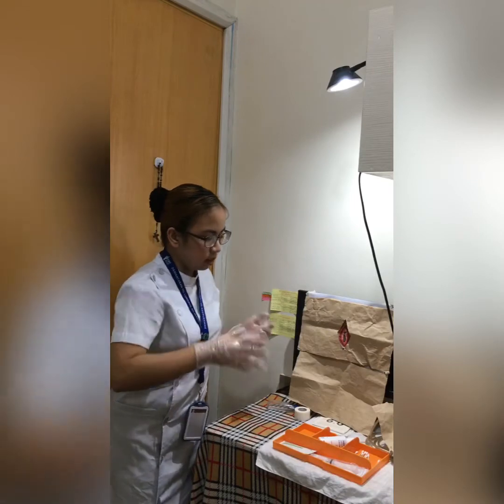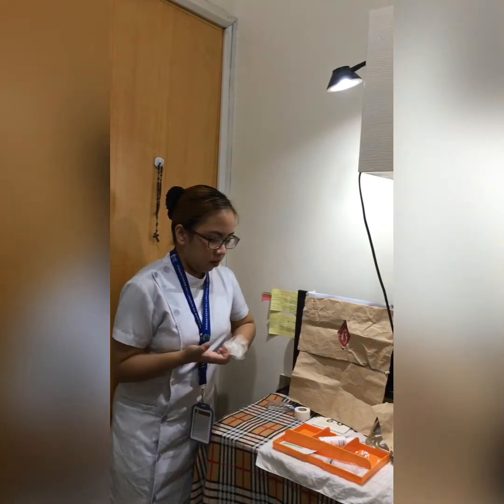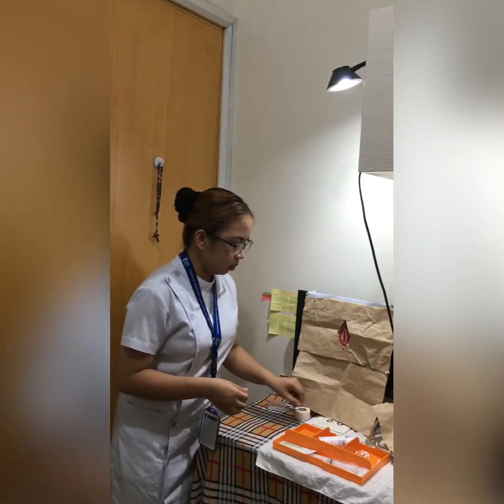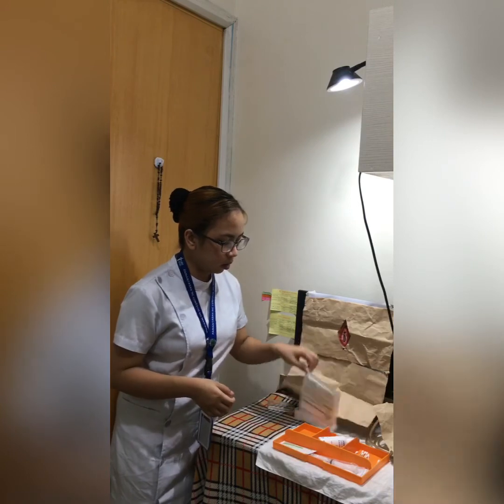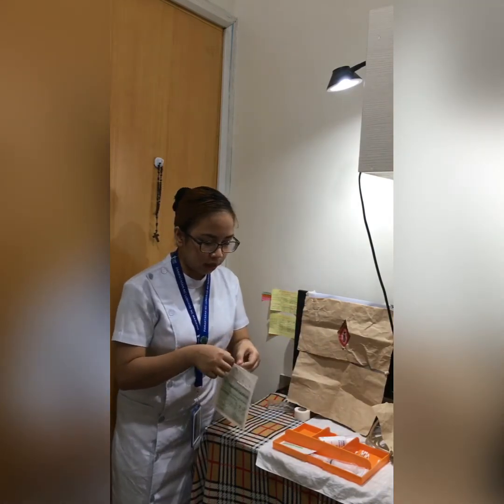The next thing is I'm going to remove my clean gloves and dispose of them. Next, I'm going to get my sterile gloves using the sterile technique.